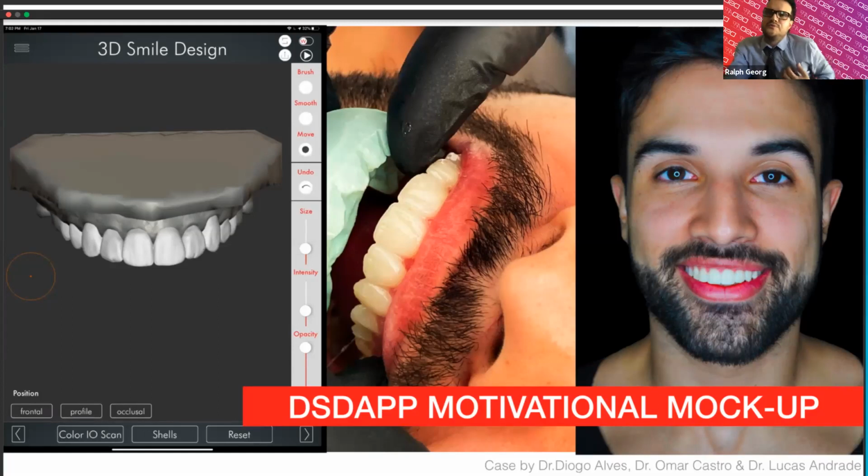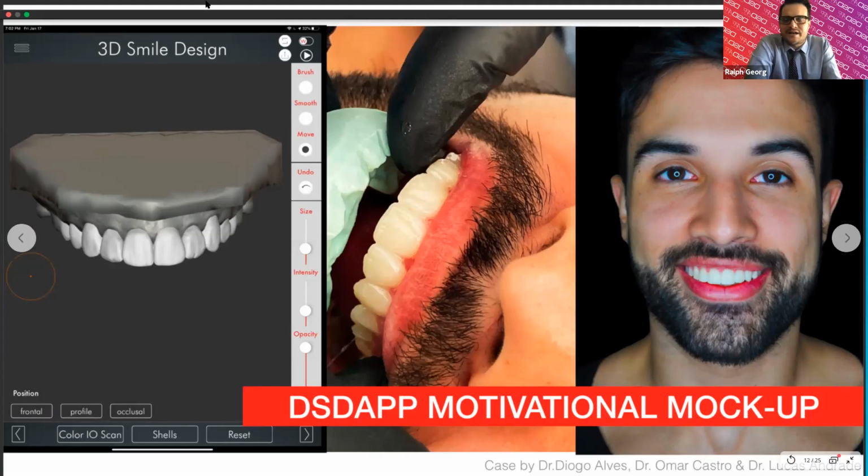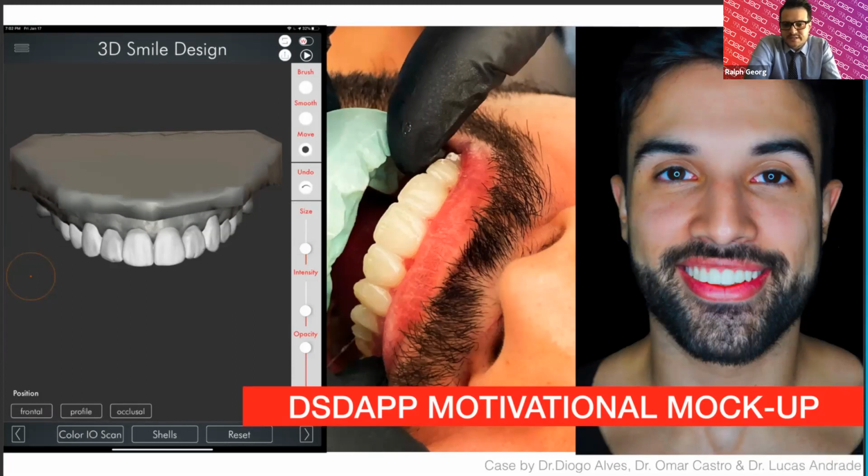And that's when you go to your patient and say, Mr. Jones, how would you like to test drive your smile? And then they say, huh? How do I test drive my smile? Well, let me show you. And then you go into that motivational mock-up, and it's just a really great tool to use when you're trying to achieve positive treatment acceptance.